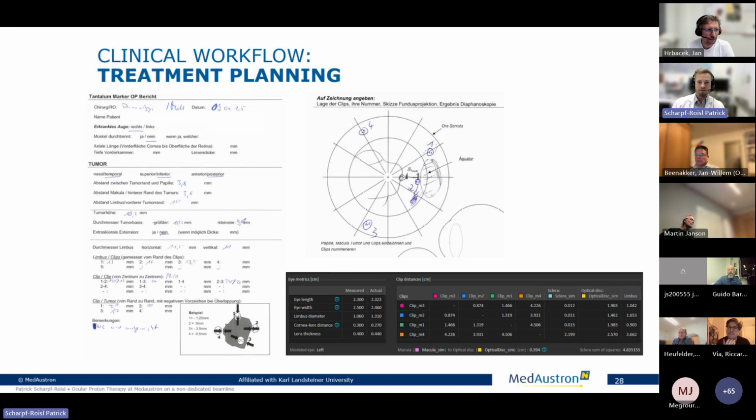It's very wide, the optic nerve sheet, especially as the eye is in a different rotational position. It's very hard to use this as a reference structure in the registration. So the clips, we'd rather have the precision of the clip registration than the additional information from an MR without clip artifacts. But honestly, the clip artifacts don't affect the tumor visible in the MR.